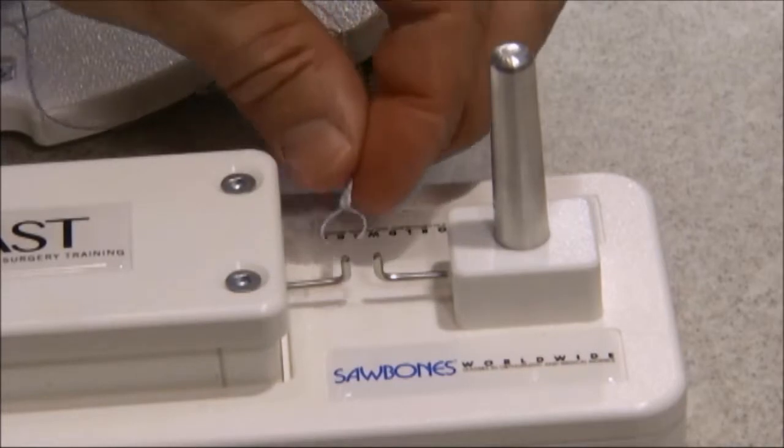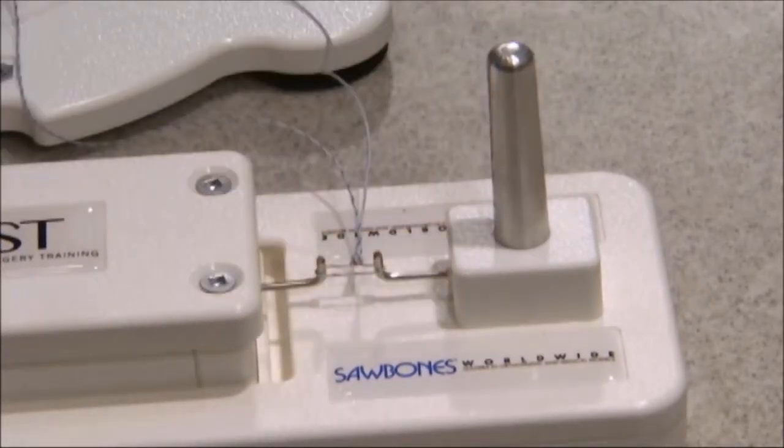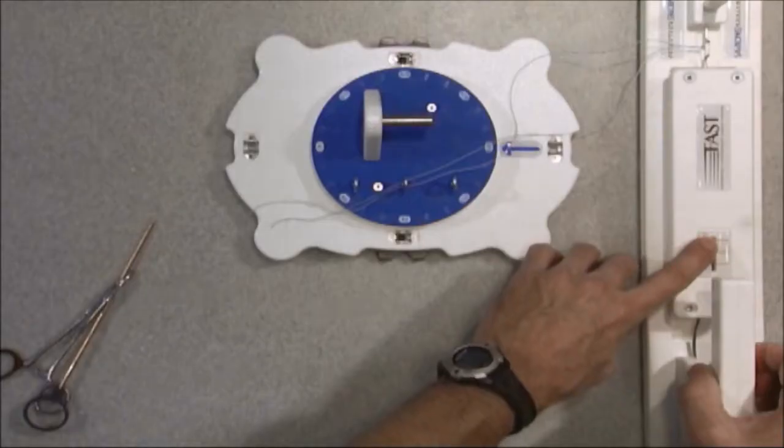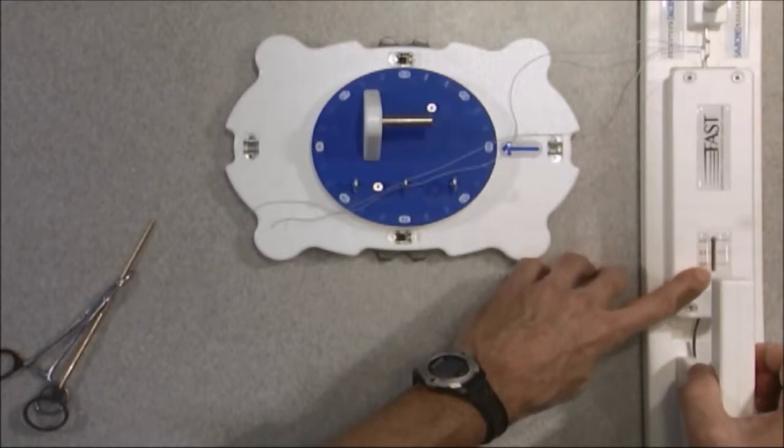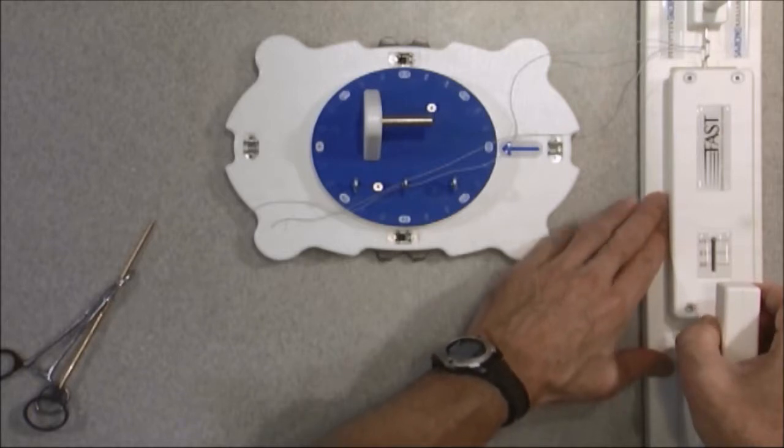And then if we zoom back out for a second, once you load the knot on there, back here on the device we have a spring gauge: 10, 15, 20 pounds. When I actuate the handle, that is going to come up and it's going to stress the loop. And so I'm going to stabilize the base.